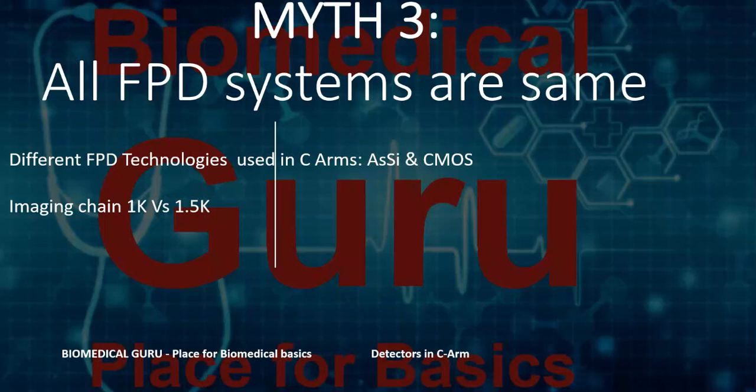Against some flat panels which have 1,500 vertical dots and 1,500 horizontal dots which make the image, which means instead of 10 lakh dots, 1,000 into 1,000, versus 22.5 lakh dots, which is 2.25 million dots in some other machines. And also it depends on the dose saving techniques.